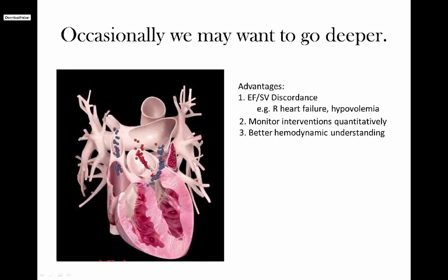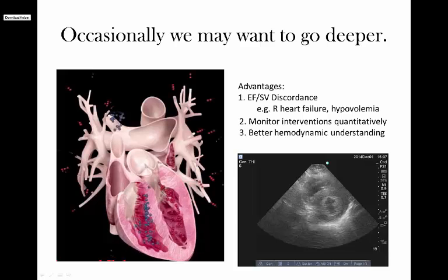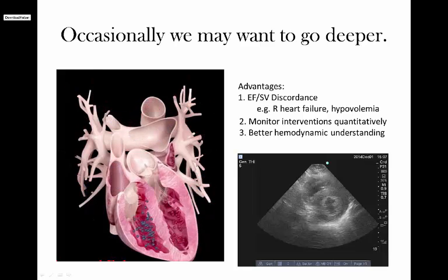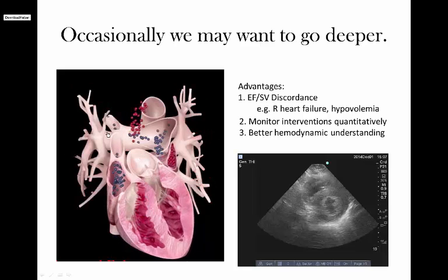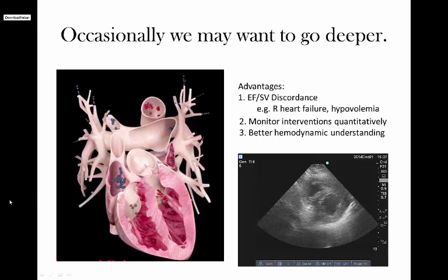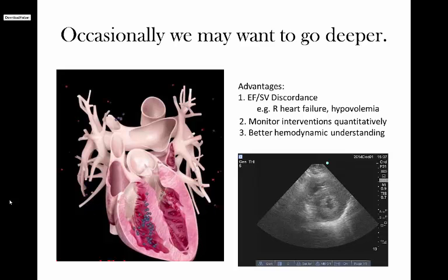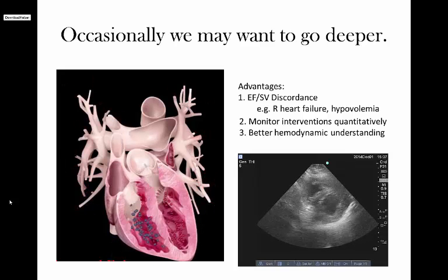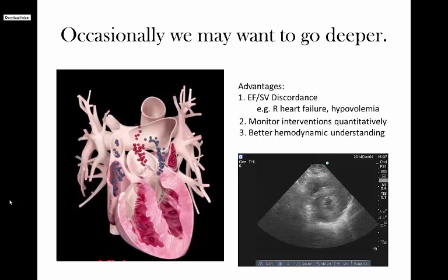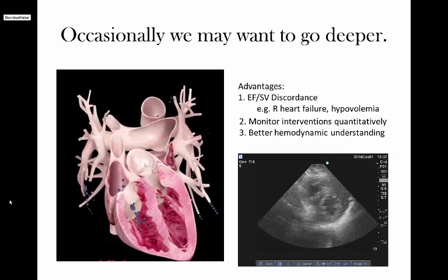More simply, hypovolemic shock is a great example where the EF might be reassuring, such as being 80% or 90% even in some examples, such as the one shown here at the bottom of the screen, where you can see the ventricle is ejecting nearly all the blood. But we know that that stroke volume is actually not terribly compatible with life. Sometimes having a quantitative measure can help resolve these more subtle circumstances, as we'll see at the end of this screencast.